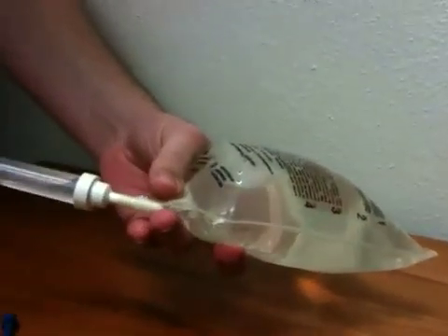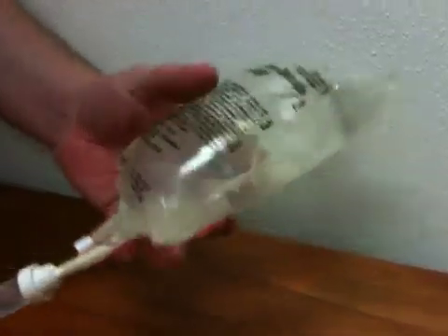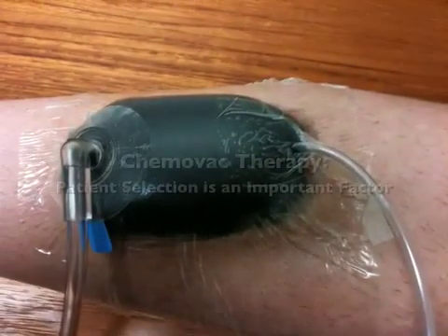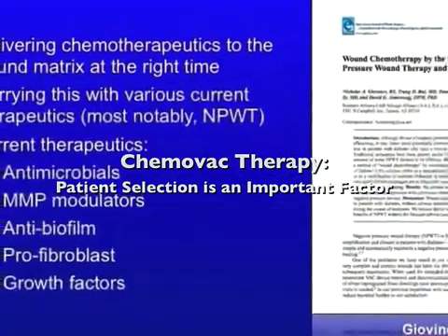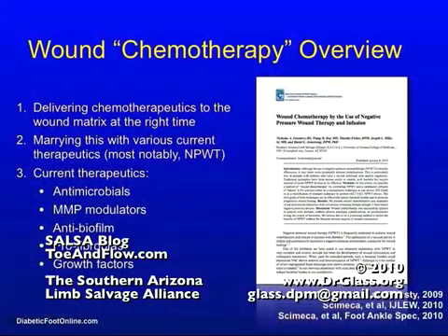A manual regulator is capable of delivering a constant and reliable infusion rate. Depending on several factors, typical rates of infusion range from 1 to 3 drops per 10 second interval, or a total of 25 cc per hour. One notable observation about the use of foam dressings with infusion ports is the increased reliance on patient compliance. In this event, the discontinuation of chemovac therapy may need to be considered in favor of standard dressings or negative pressure wound therapy.